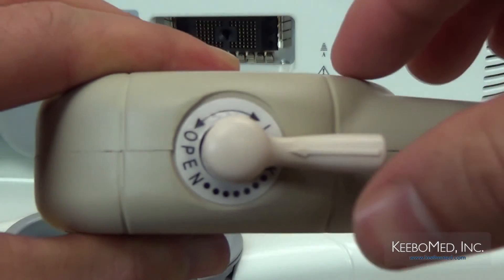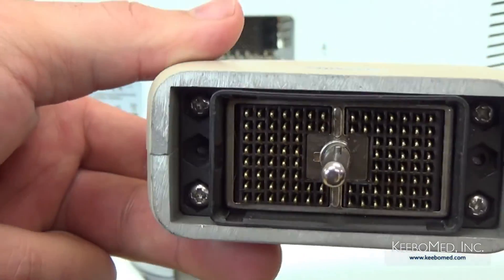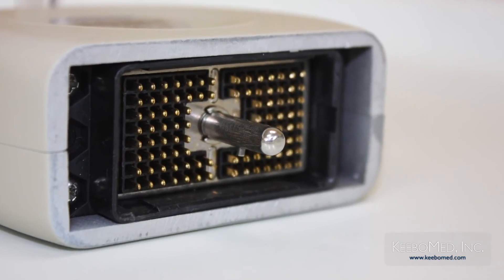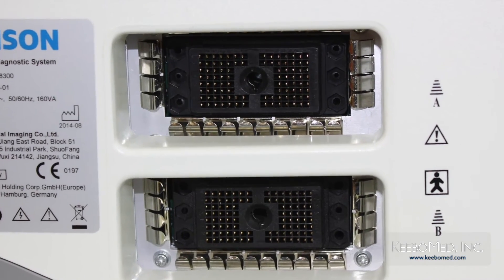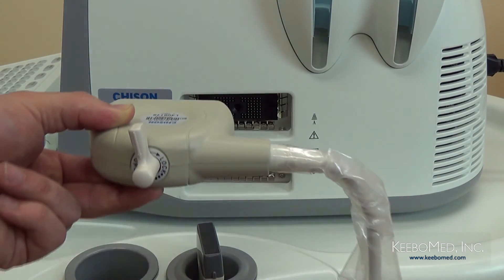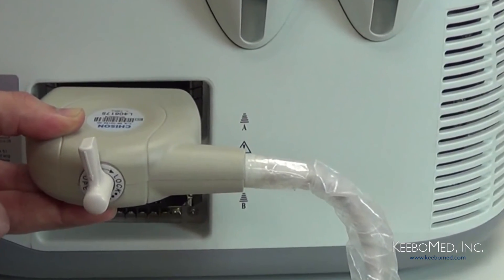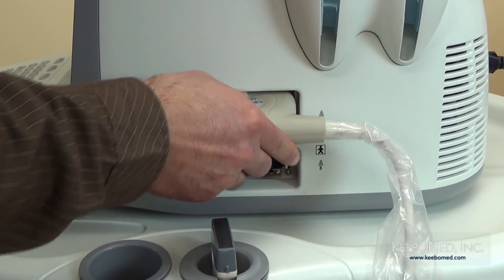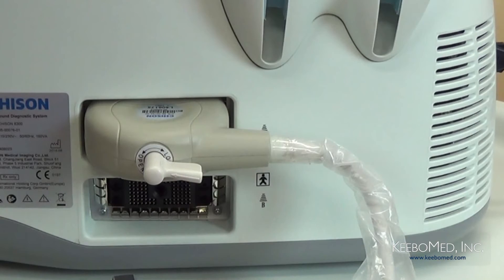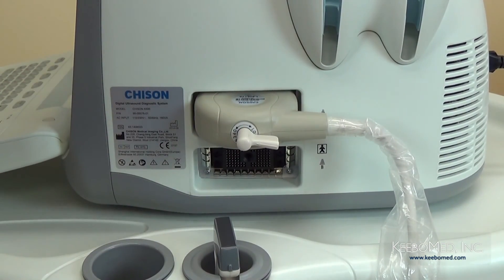Step 3, put the probe lock knob to open status and make sure that the small tongue of the probe lock inside the probe connector is at the same position of the slot on the probe socket. Step 4, make sure that the probe cord is facing toward the back of the machine and horizontally insert the probe connector into the probe socket. Hold the probe connector and turn the lock knob to the locked position. Step 5, check the probe and make sure it is securely connected.